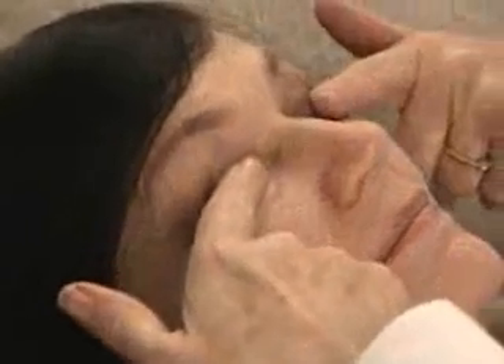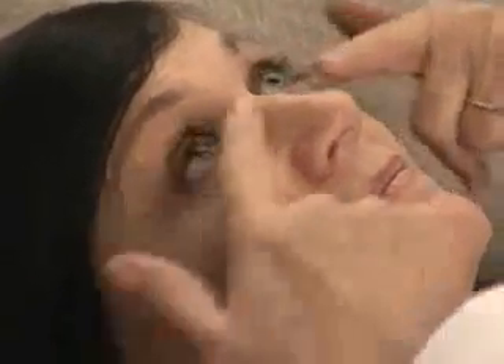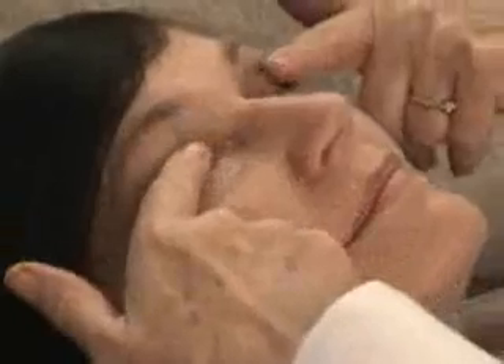You may have blurry vision for a few moments afterwards but should get some relief from your symptoms almost immediately. You may need to use the eye bag 2 or 3 times a day for a couple of weeks to get the best results.